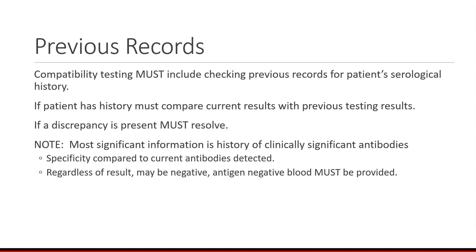And regardless of the result, it may be negative because now the antibody has fallen below the level of detectability. You must give antigen negative blood for the rest of that patient's life. I want to say that one more time.